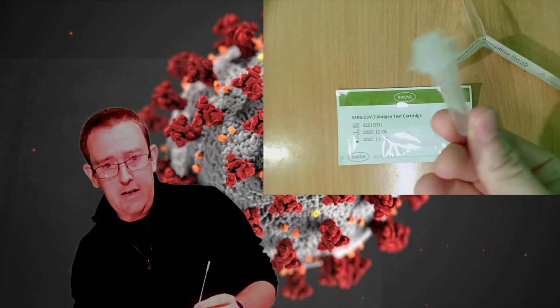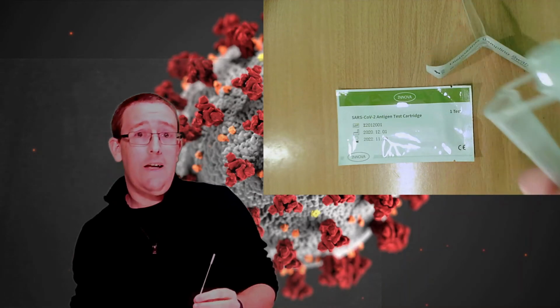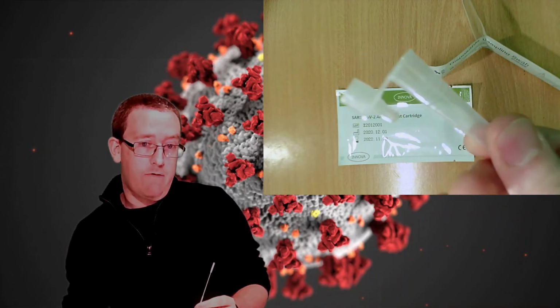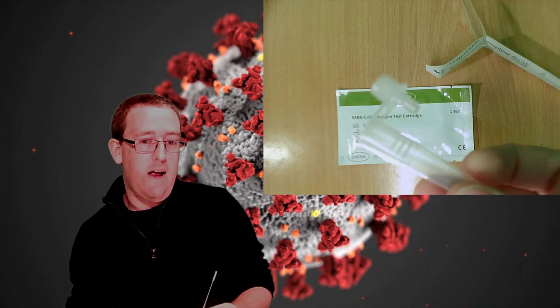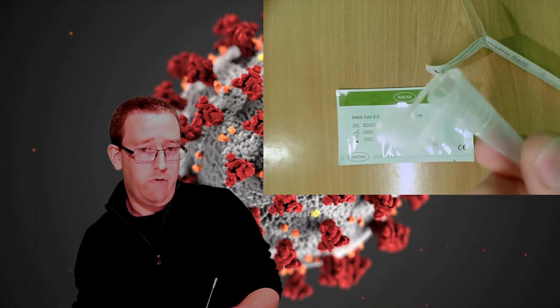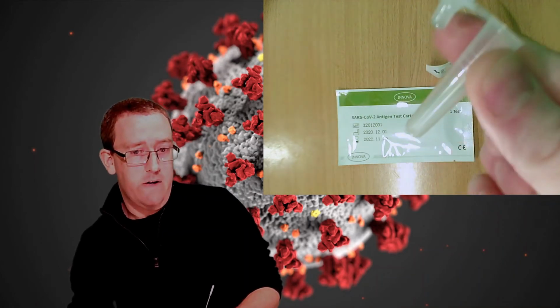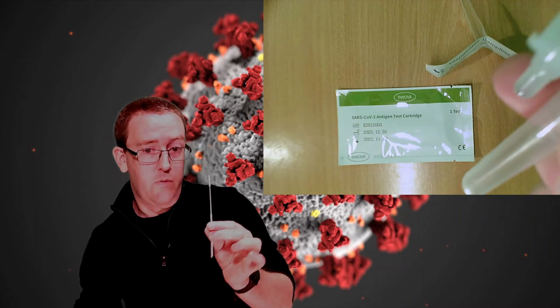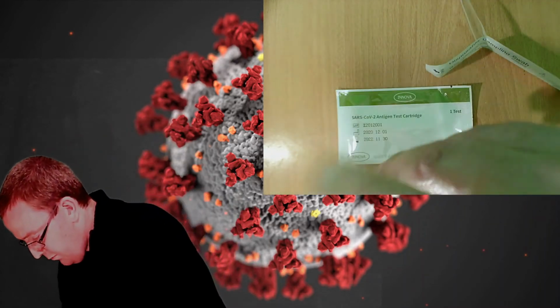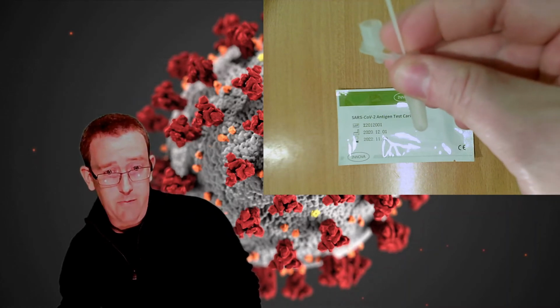Now, this is the testing tube. Into that, someone like me will already have put 6 drops of the lateral flow testing fluid, which will have the first set of antibodies in it and some other chemicals to help break and separate out the particles. So that'll have 6 drops of liquid in the bottom there, and the student or patient will just place the swab in the tube and hand that back to me.